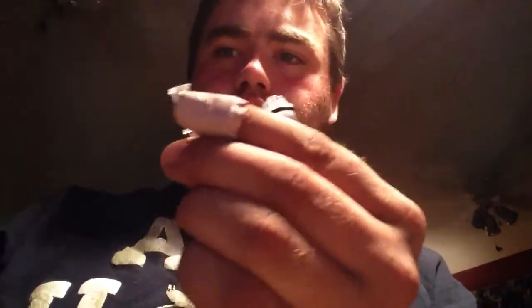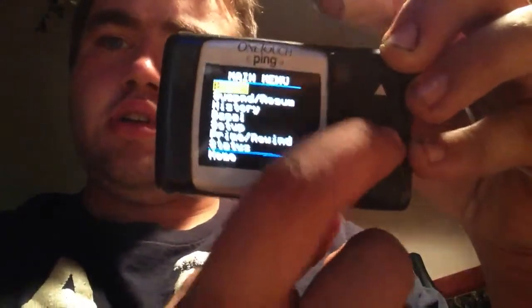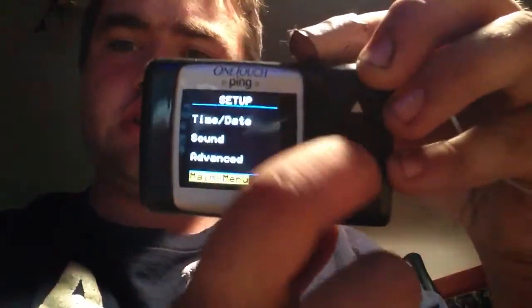Now, I just need the tubing. Open it all up. So put the cartridge cap around this so that I can get it on, and I just screw this onto the cartridge. Next step is to put the cartridge into the pump and screw that on. In my menu, it's a little tough because it's kind of reversed to me right now, in a mirror. I go down here to setup. Oh, not setup. I go to prime rewind.